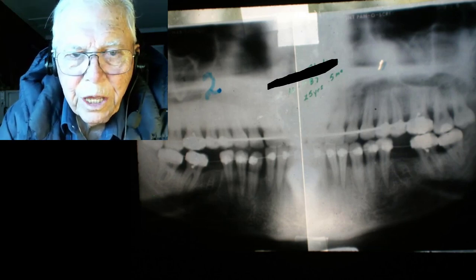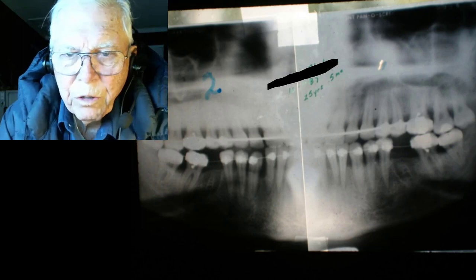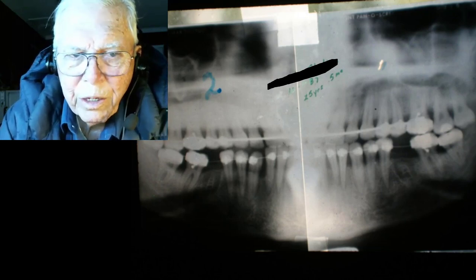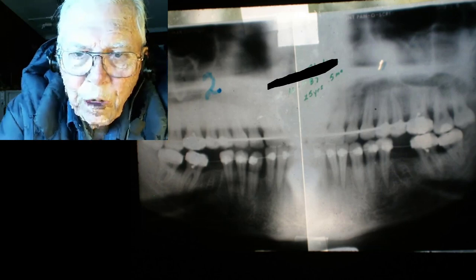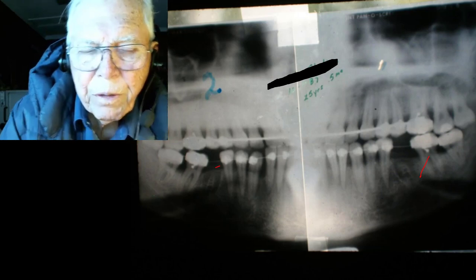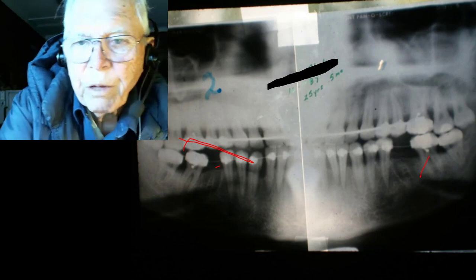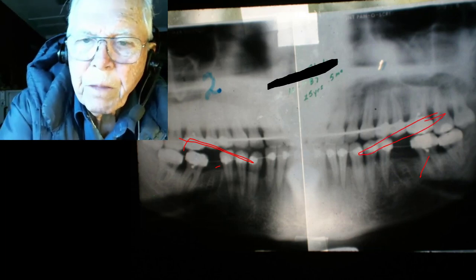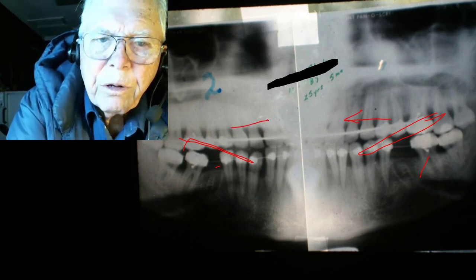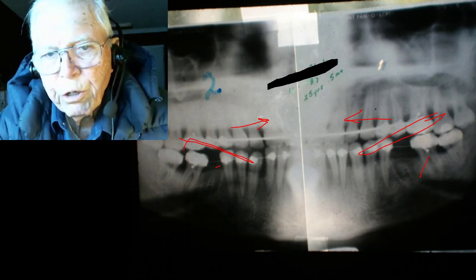Here's the second panoramic — we've taken the teeth out, put the wire on, and started pulling it together. Nowadays we don't use this small wire to pull; we go to a heavier wire so we can put some torque on the roots and bring them forward. This is your periodontally involved tooth we're moving. We also use some Class 3 elastics to close the space, which brings the upper arch out some.